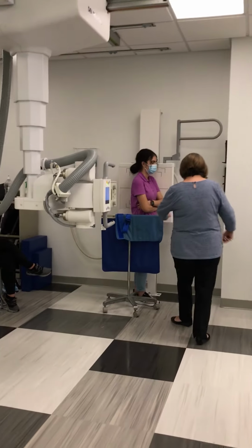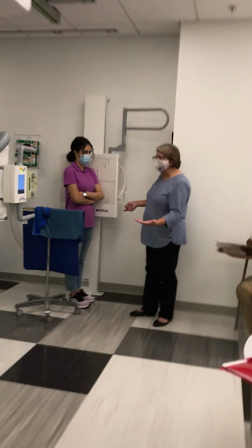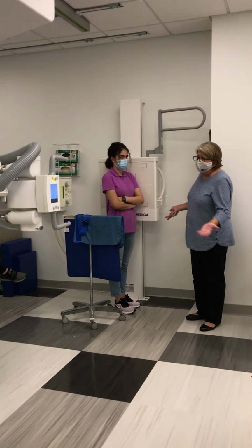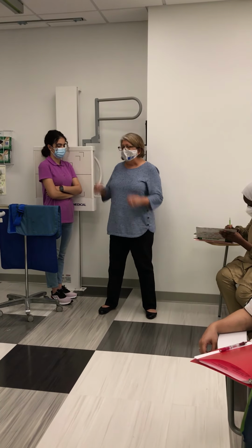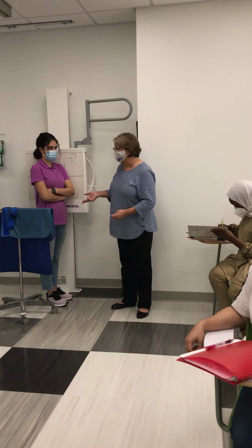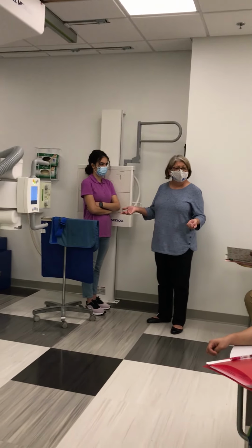Something else that I need to tell you is these are instructions that you need to give verbally. Raise your chin, stand with your feet shoulder width apart, because your patient's going to be your classmate and they're going to know the same stuff you do. But if your patient comes over here and they stand like this, yet you don't give those instructions, you won't pass your simulation, because I won't know that you knew to do that and you just got lucky.